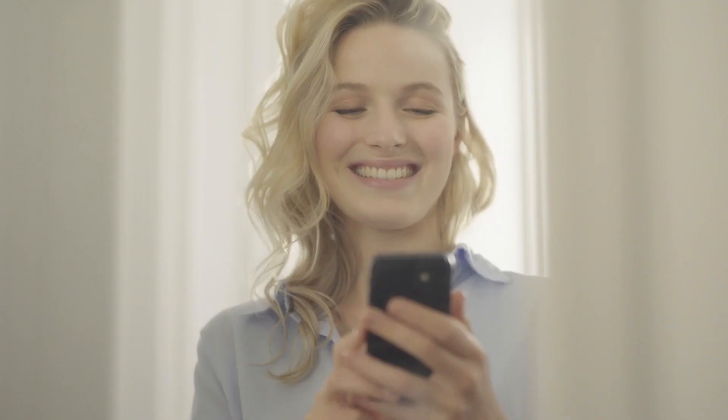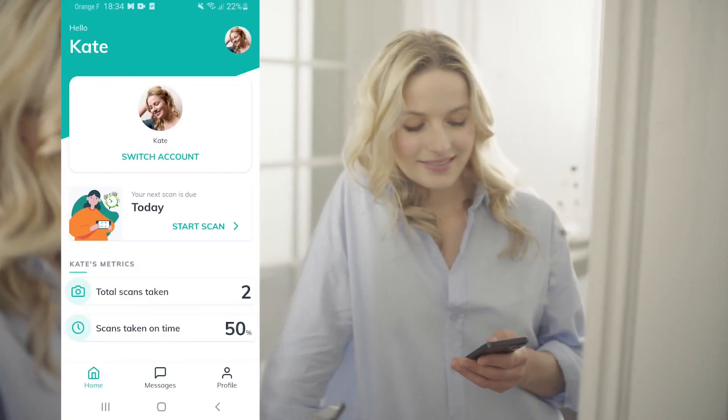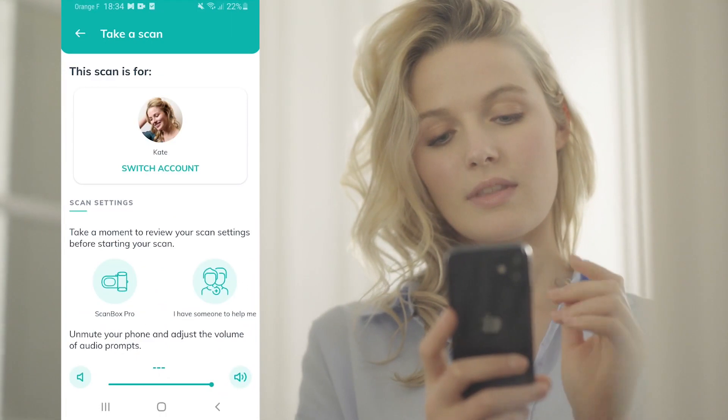Stand in front of a mirror. Open your application — it is intuitive and will guide you. Press the Start Scan button and follow the instructions.